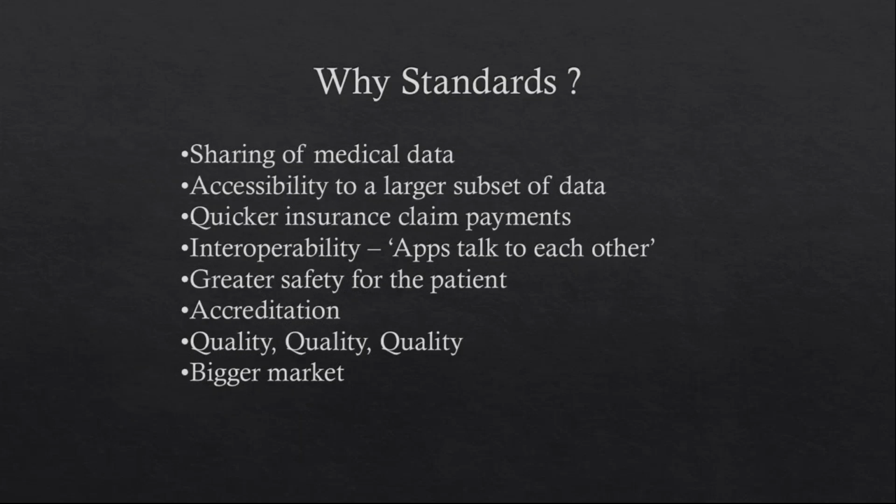Okay, and why do we need a standard? Sharing of medical data is very critical, and we cannot have any format of message just like that to transfer medical data from one system to another system. So to make sure that data is transferred accurately and in the proper format, we have come up with a standard, which is the HL7 standard.